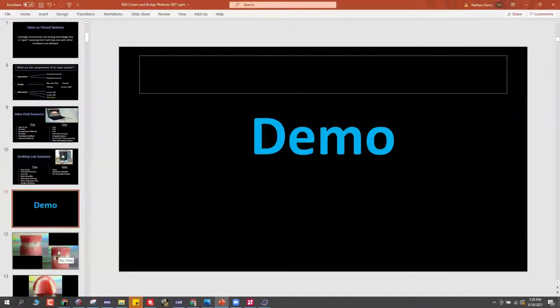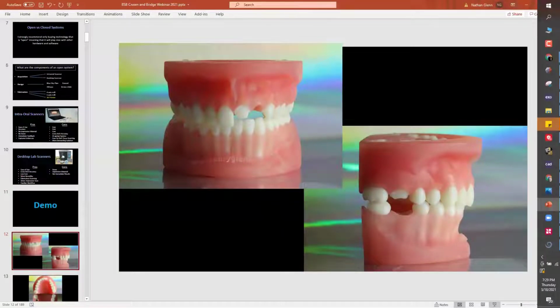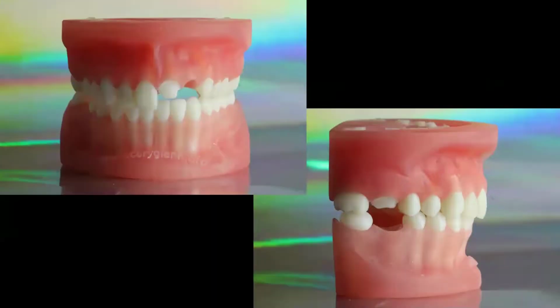Okay. Let's see what do we have here. Is digital articulation possible with the crown and bridge module? Using your software to design a full arch case for a patient as a D4 at UNC. Just want to say thank you for offering a free solution, especially for students trying to learn digital workflows. I appreciate everything you do.